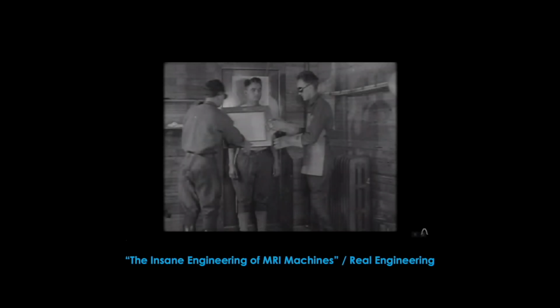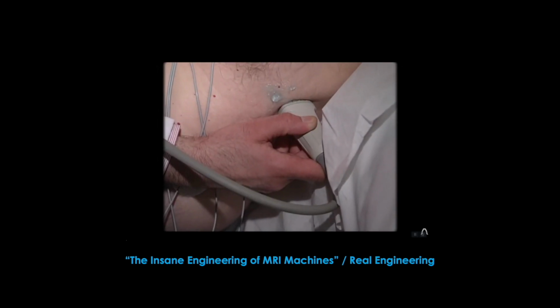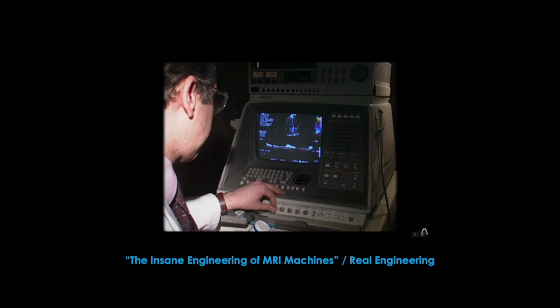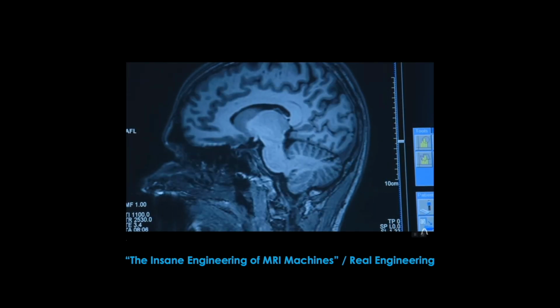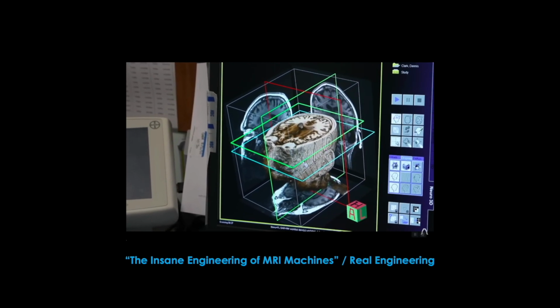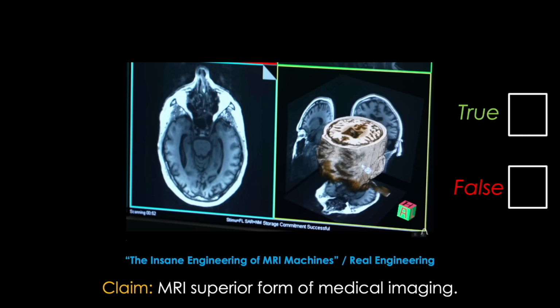Okay, let's go back and watch a clip near the very beginning and see if we can address a major question. Prior to their introduction to medicine, we peered inside our bodies using harmful ionizing X-rays or low-detailed ultrasounds. While incredibly useful, even to this day, these two imaging techniques pale in performance to the safe millimeter resolution of MRIs, capable of creating a 3D reconstruction of the body rather than a flat 2D image. Claim. MRI is a superior form of medical imaging.